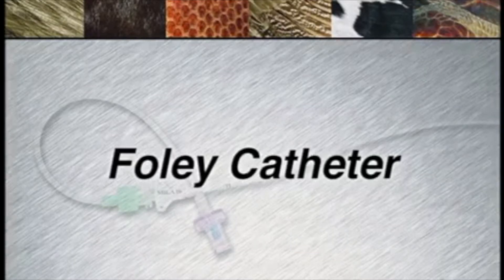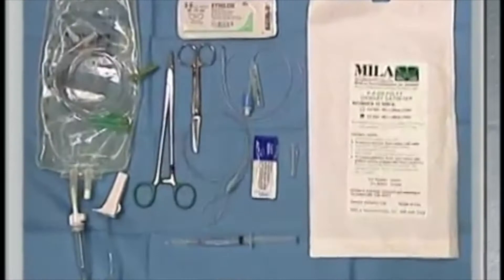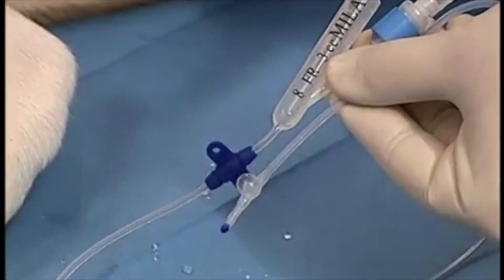Foley catheters are indicated for long-term indwelling urinary catheters. The following supplies will be needed. The Foley catheter is a soft flexible silicone catheter that is very non-irritating and non-reactive.